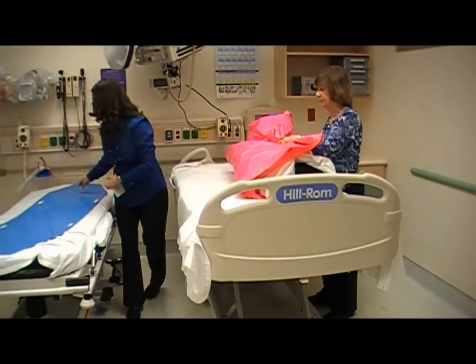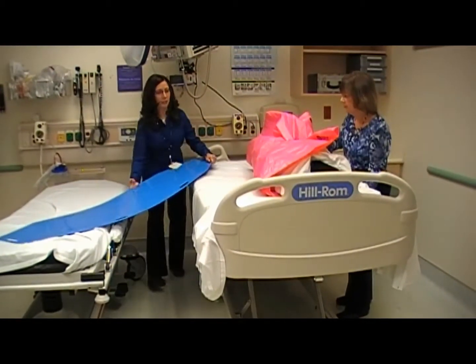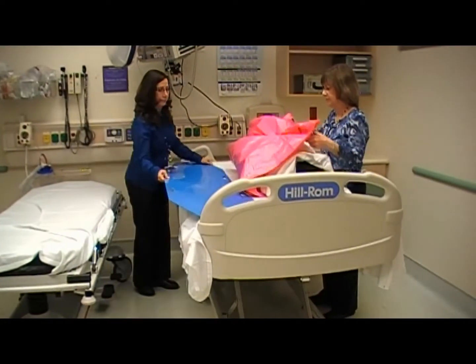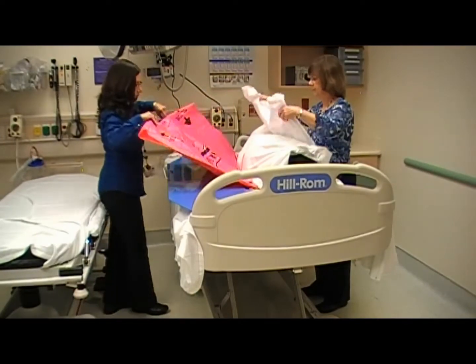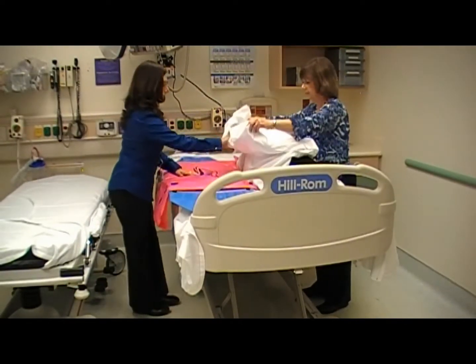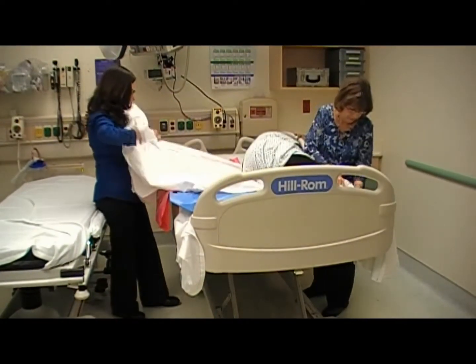If using a slide board, insert it between the bed and the pink slip. Slide boards can be used to assist the bridge of two uneven surfaces or to make transfer easier for larger patients.